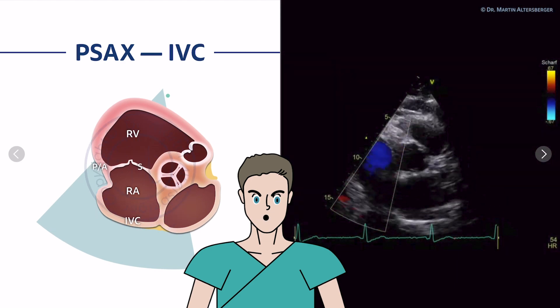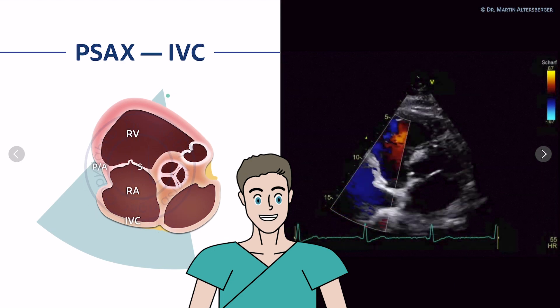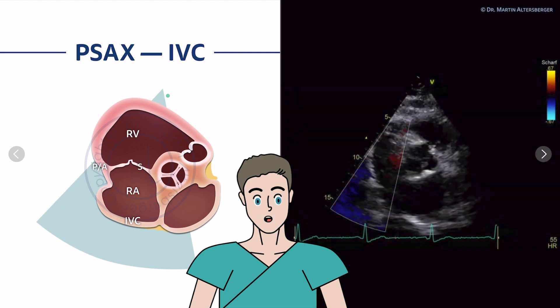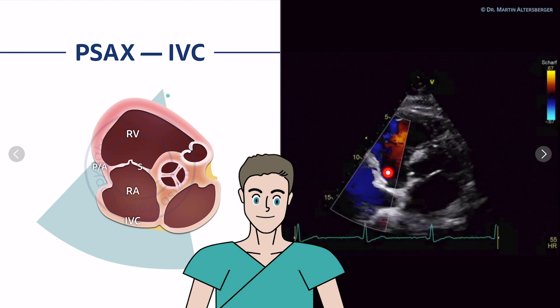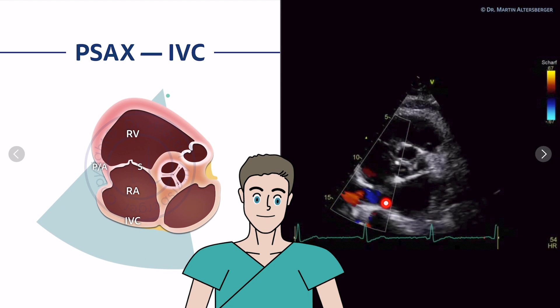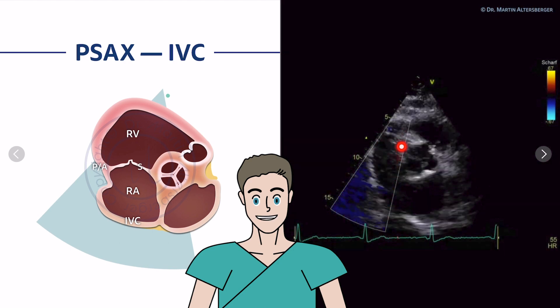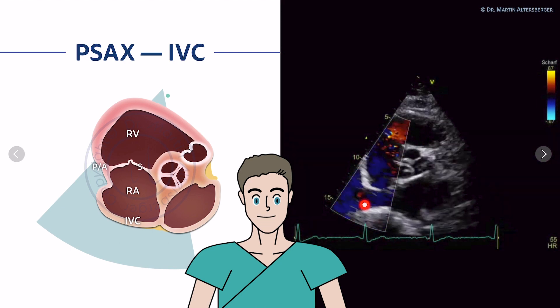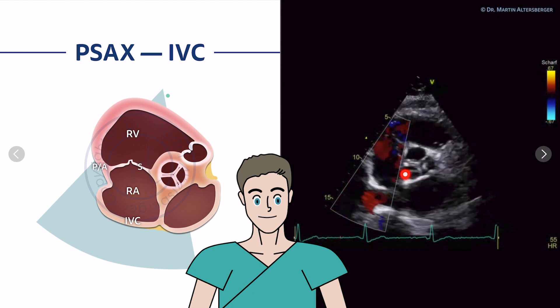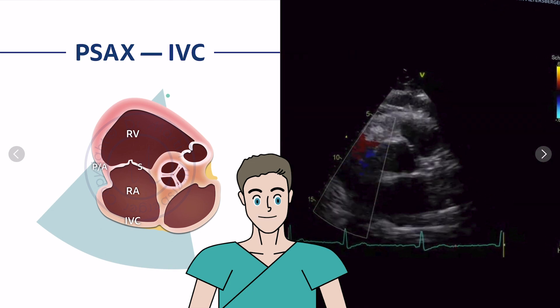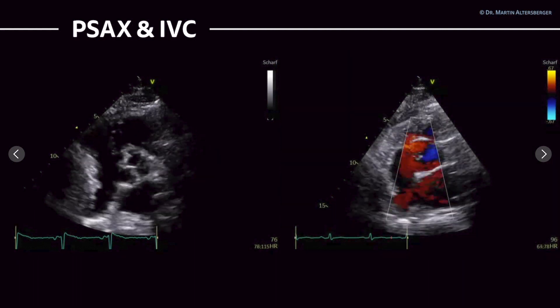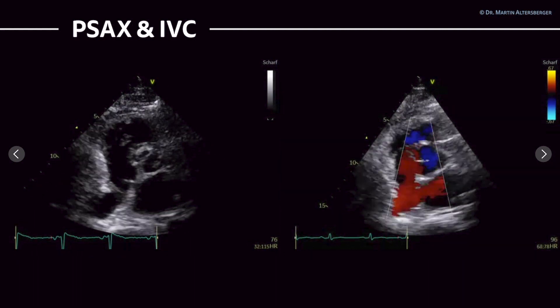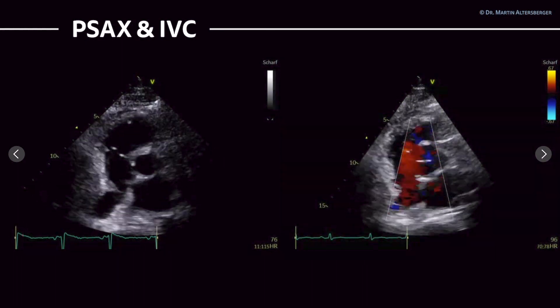Another structure you can see — and shouldn't mistake for pathology — is the IVC, the inferior vena cava. With color Doppler, you can confirm the structure is entering the right atrium. Here we see the interatrial septum, the tricuspid valve with trivial tricuspid regurgitation, the RVOT, and the IVC in the center, as well as the aortic valve. Two more examples show a very prominent IVC, confirmed again with color Doppler.